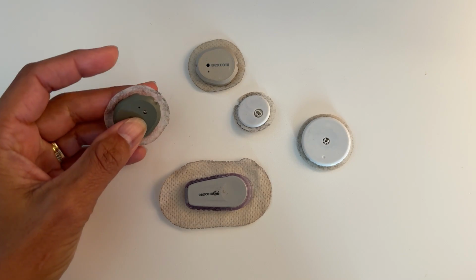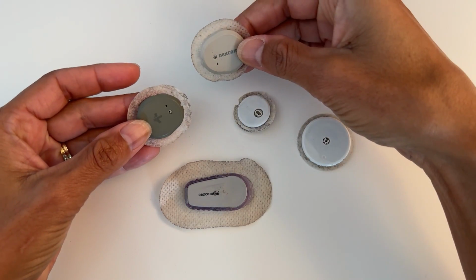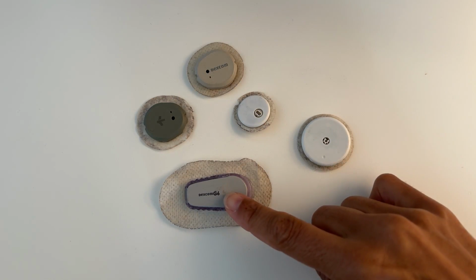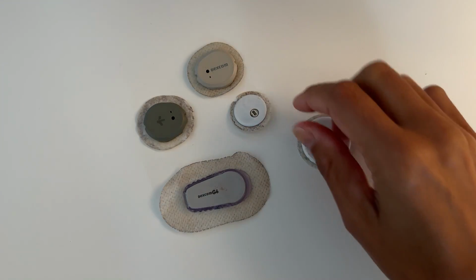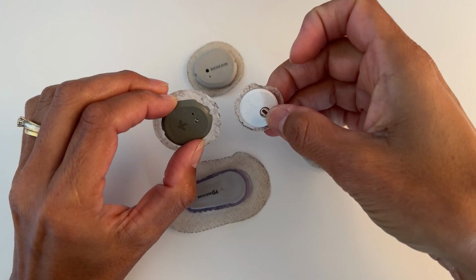This is Stelo. It's the exact same size and form as the Dexcom G7, which is the sensor that I currently use. And Stelo is just gray. And here we have Dexcom G6, the Freestyle Libre 2, and the Freestyle Libre 3. So it's larger than Libre 3, but it's smaller than the other older sensors.